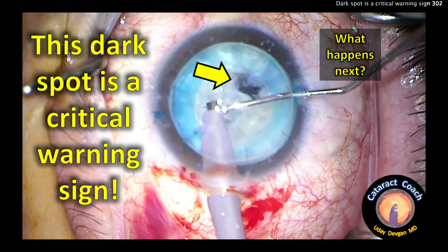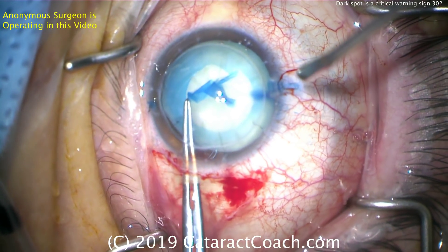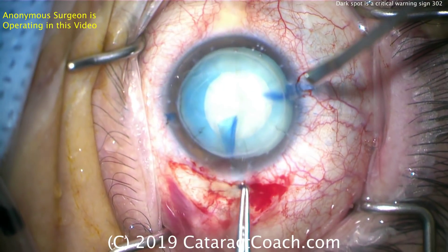cataractcoach.com. This dark spot is a critical warning sign — if you see this, it's going to be tough. This is a great teaching video. I want to thank the anonymous surgeon who sent in this video. It's very instructive. We can all learn from it.